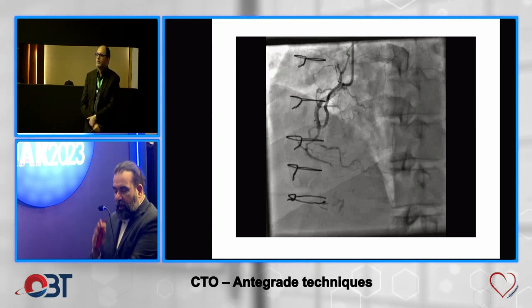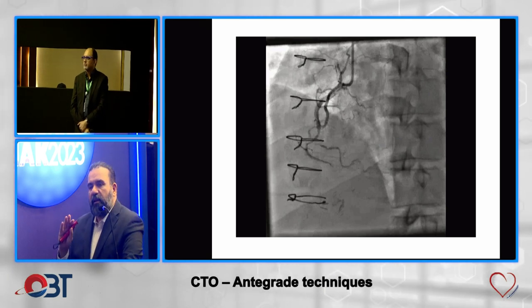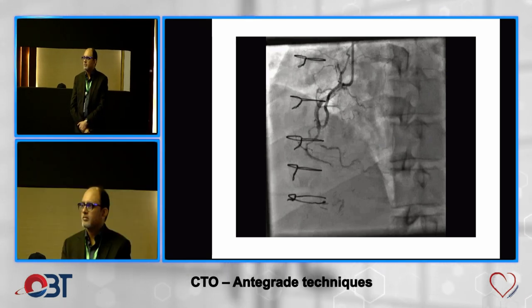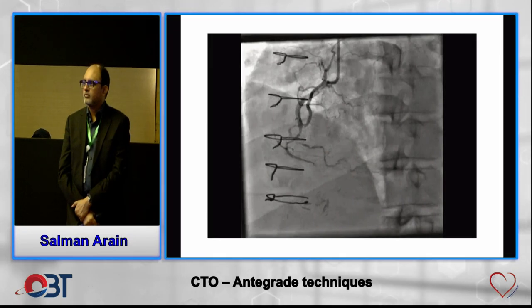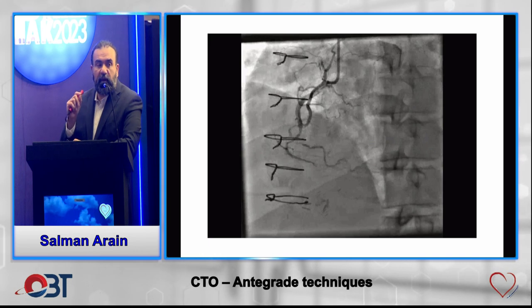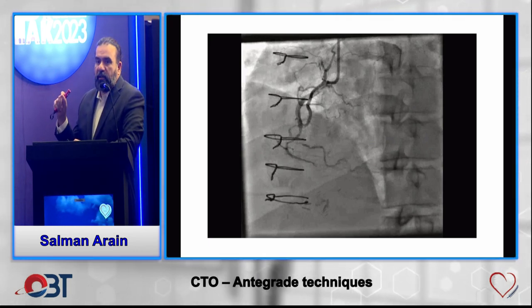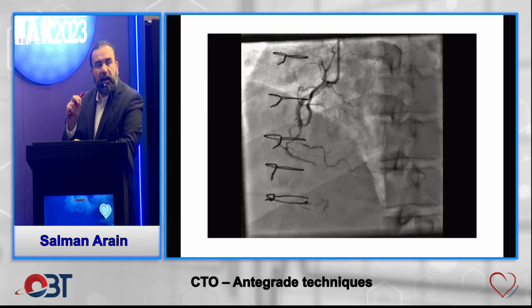Beautiful. It's like you read my mind. Exactly. Better guide support, you need good guide support. If you don't have a guide extender, that's okay. Here a microcatheter is needed because of the tortuosity. So one question that often comes up is, why don't we use an over the wire balloon? Because an over the wire balloon cannot do so many turns and stay as mobile and flexible.